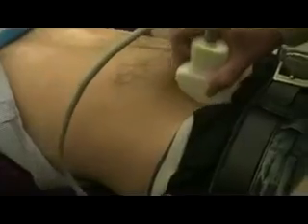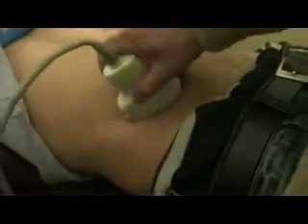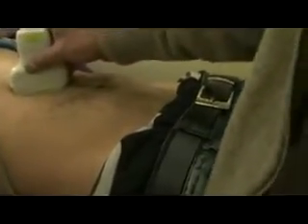I'm going to scan this 32-year-old male with the history of dull abdominal pain. That is the only history available. No lab profile is available, and no other imaging modality facility is provided. I'm going to start from the sub-epigastric region. As I move down, you will see a bowel-related mass extending from the right hypochondrium down to the paraumbilical region, or even into the right lower abdominal quadrant. In this region, we will also see para-aortic lymph nodes.